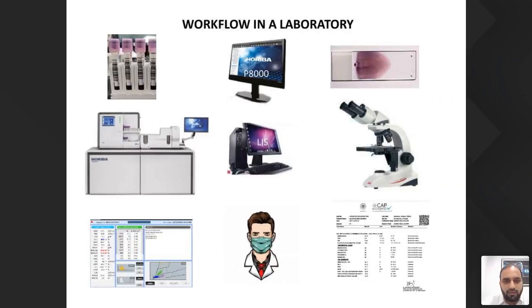Now, a slide can be made on request, or with this middleware, especially this P8000, we can put in some reflex criteria. I have put them in according to my needs in my lab. Everybody has their own choices. There are guidelines also, recommendations from ICSH, and accordingly we can put in the slide reflex criteria. So the slides are automatically made on the slide maker and stainer, which gives good quality slides coming to me. I look into the microscope and then report out, and whatever comment I have to put in, I give it.